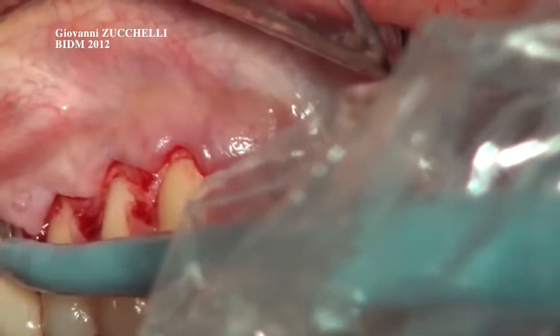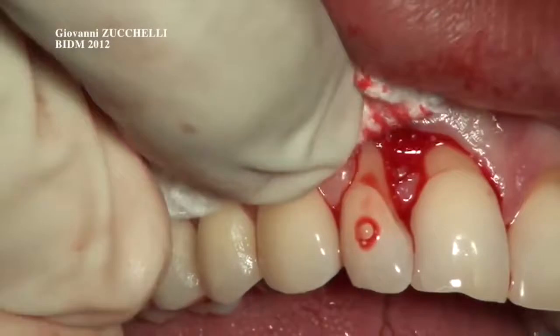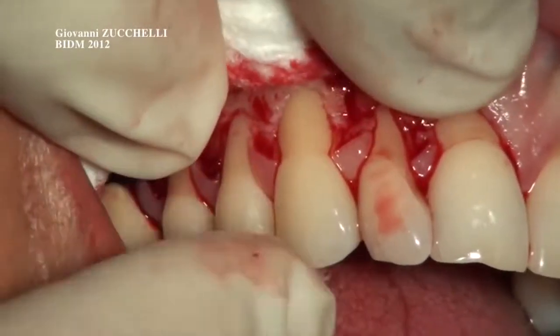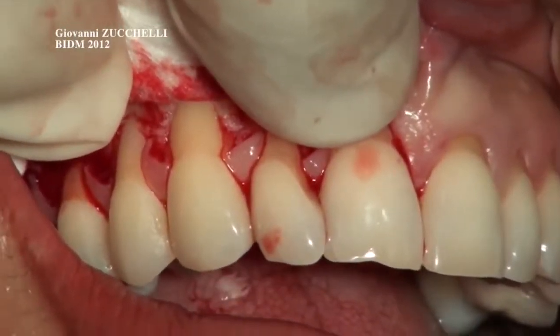And with the gauze you are going to make some compression of the soft tissue in the most apical part together with your flap, and make the root coverage, the root treatment, in a very clean operative field, with absence of bleeding. Correct.